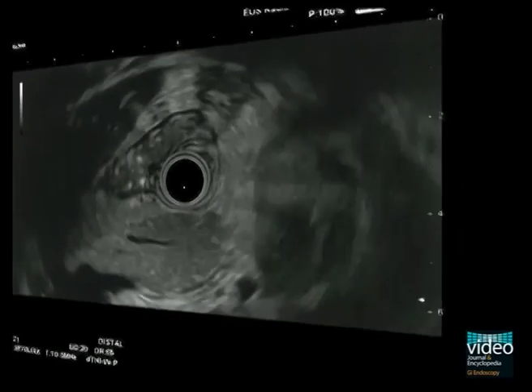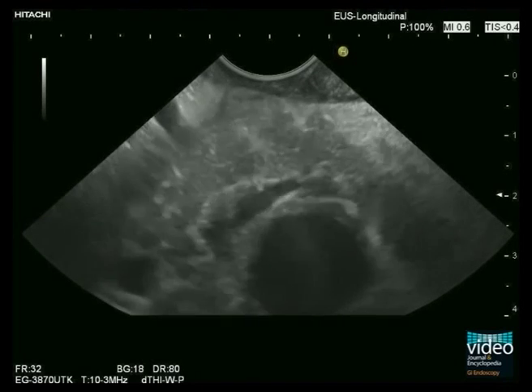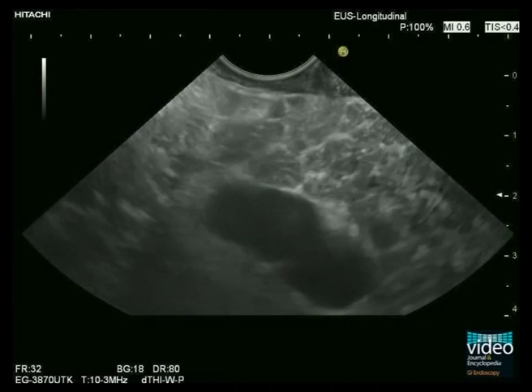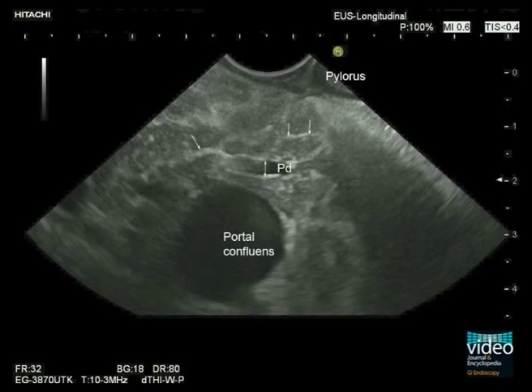However, in contrast to these two cases, in most cases of recurrent acute pancreatitis with endosonographic features of chronic pancreatitis, detailed and repeated history reveals relevant alcohol intake, as in this case of a 57-year-old male patient. We find typical diagnostic criteria of early chronic alcoholic pancreatitis: a honeycomb appearance of pancreatic parenchyma, hyperechoic stranding, and non-shadowing echogenic spots, and a slightly dilated and irregular pancreatic duct.